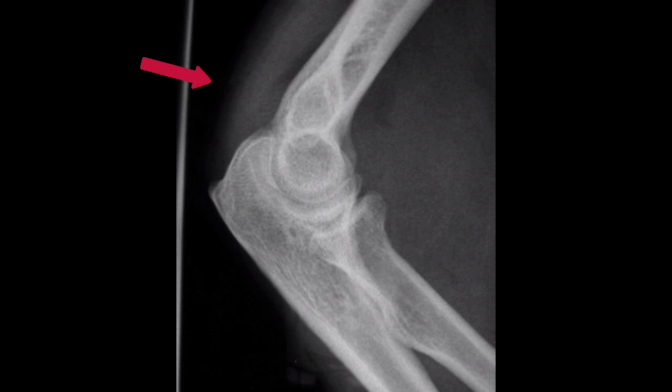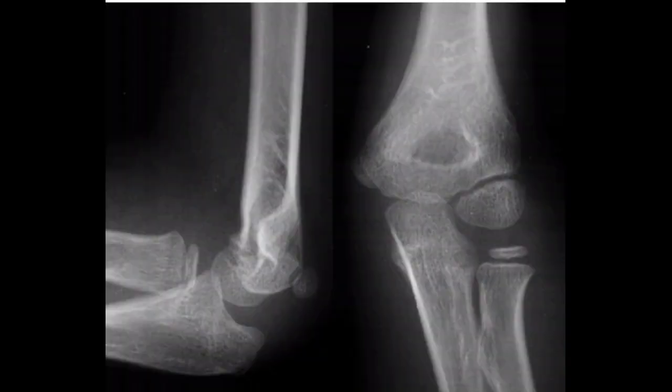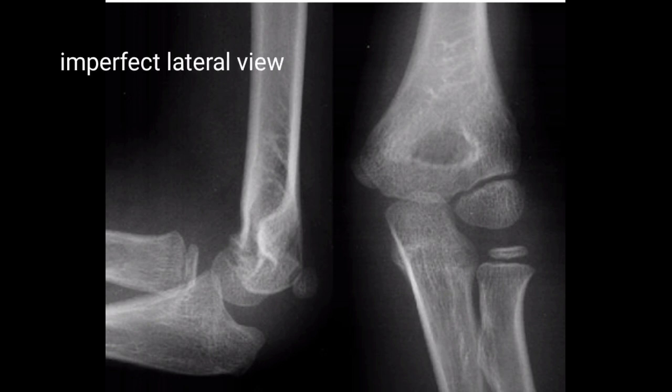Also notice the posterior fat pad. In this image, here is an imperfect lateral radiograph accompanied by a normal anterior-posterior radiograph. Notice how the figure of eight hourglass sign is asymmetric.